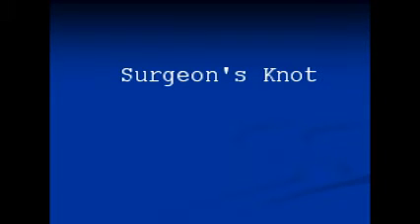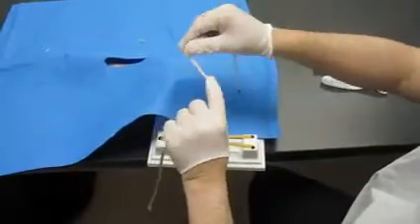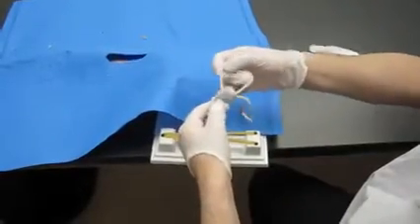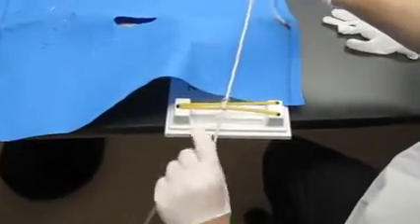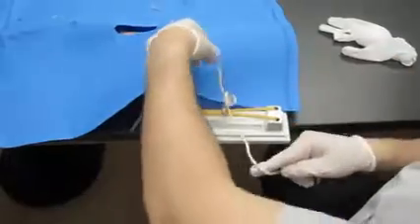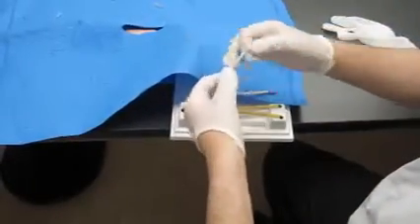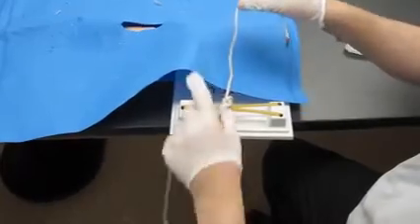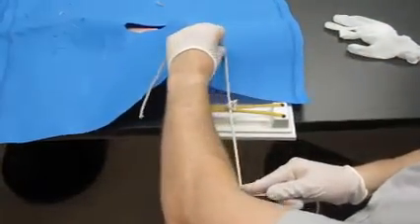And what about a surgeon's knot? On a surgeon's knot, the only thing that's different is on the first throw, you pass the suture through twice. So there's a double throw on the first throw. But on the second throw, you go back to the normal one single throw. The tail goes in the opposite direction. And you continue as normal — one more throw to this side, pass the tail through, and to the opposite side.